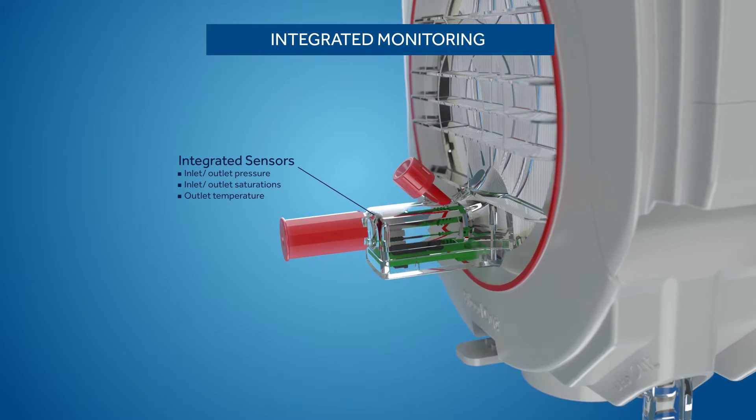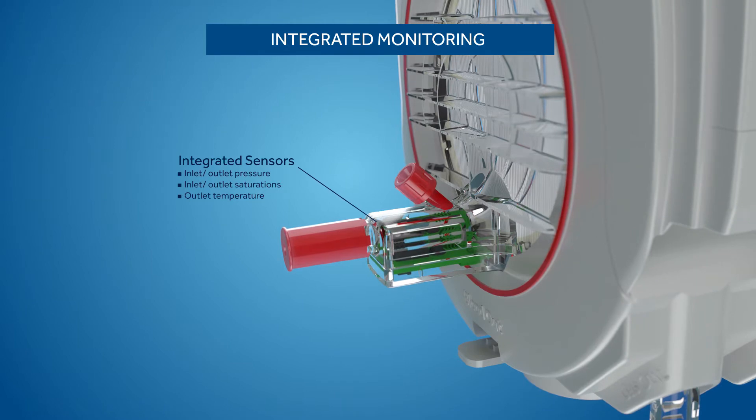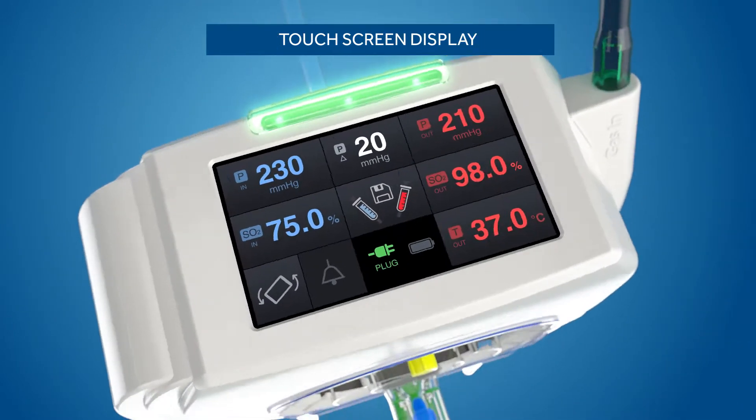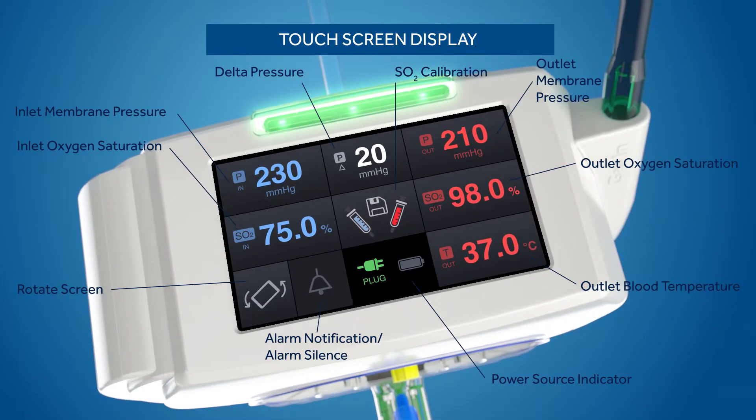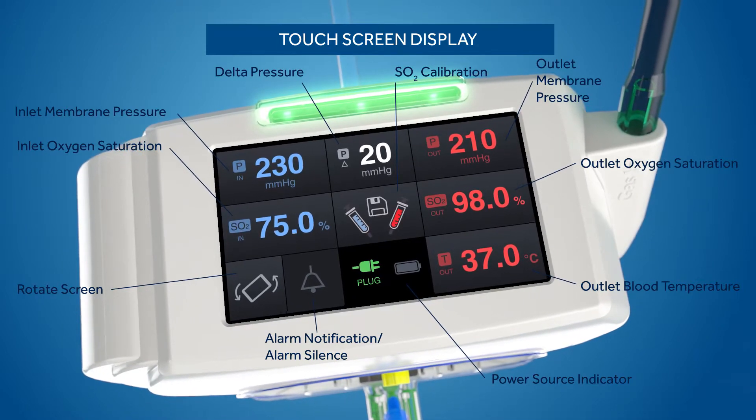Integrated sensors in the blood inlet and outlet ports measure pressure, oxygen saturation, and temperature. Monitored values are displayed on the touch screen. The touch screen also allows for SO2 calibration.